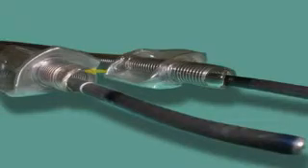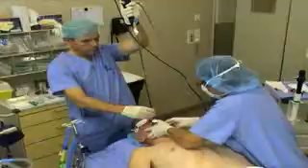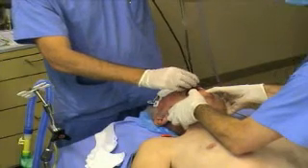It is very important to minimize the gap between the tube and the fibroscope, since a small gap decreases the likelihood of difficulty when advancing the tube over the fibroscope, especially in the posterior arytenoid region. When performing oral fiber optic intubation, be sure that the chin lift and jaw thrust maneuver is adequate and be certain that the slit oral airway is the right size. In general, for adults, a number 4 slit airway is the appropriate size. If the oral airway is too large, it will obstruct your view through the fibroscope as you advance towards the glottis.